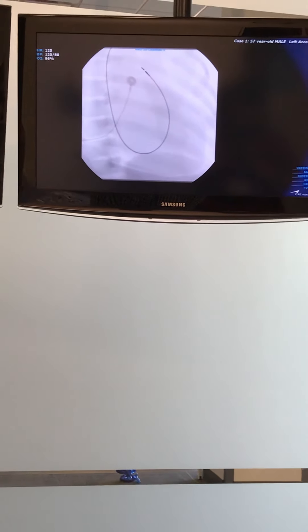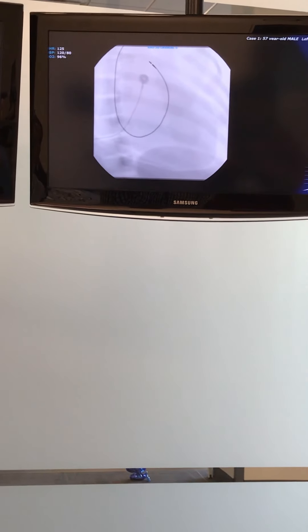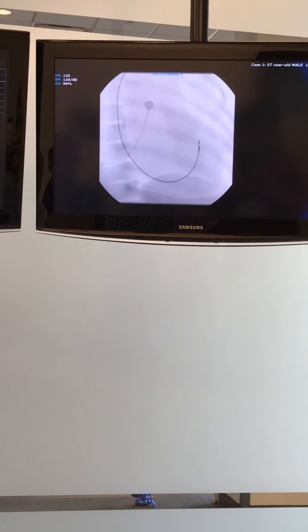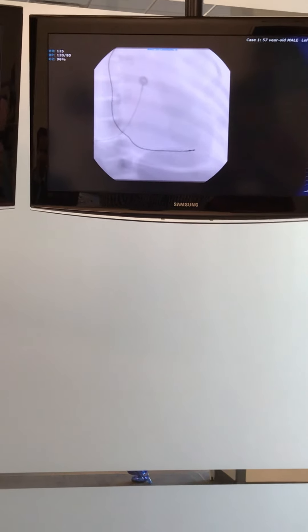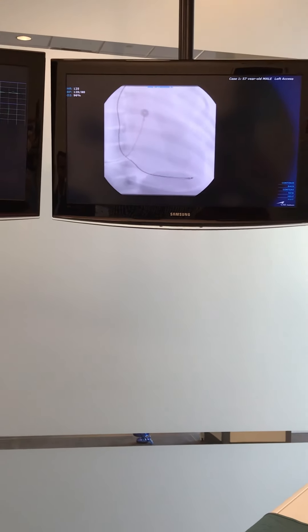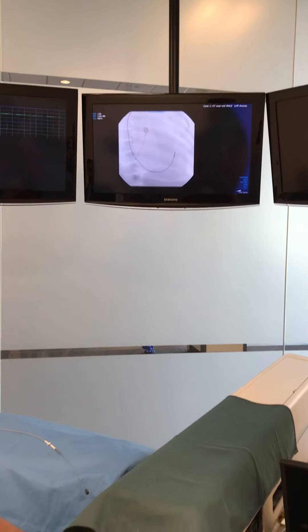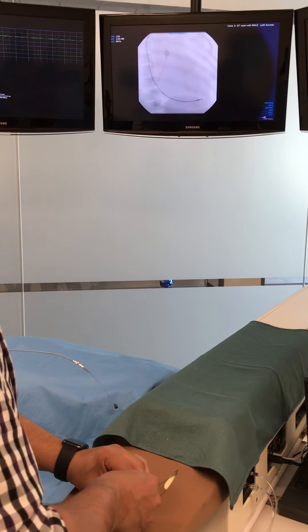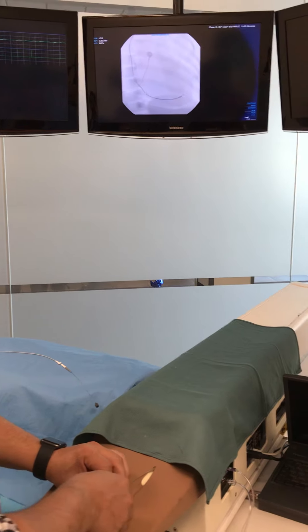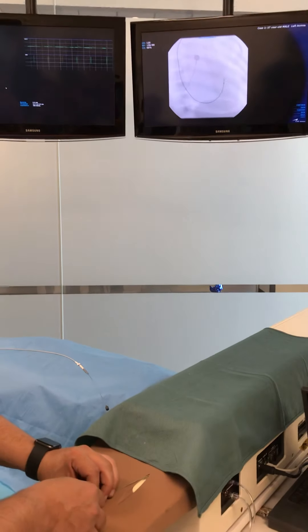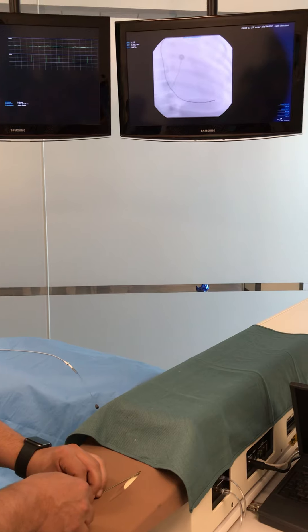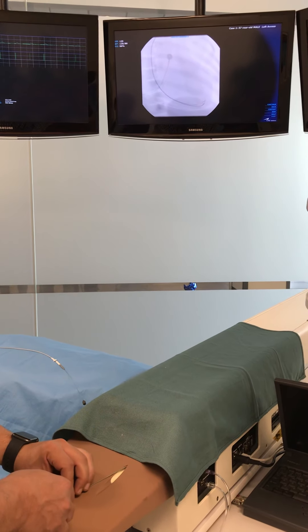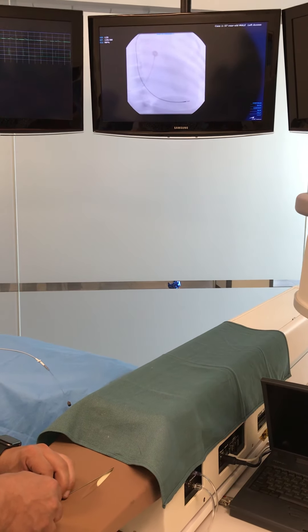Now you're going to just draw your lead back. Pull it back until it falls. Keep it engaged. When you see it fall low, good. Now you can advance it slowly. A little bit of craziness there on the sim. Draw your lead back just a little bit, and it will be a little bit more stable for the simulation. Good. Back a little bit. Right there.